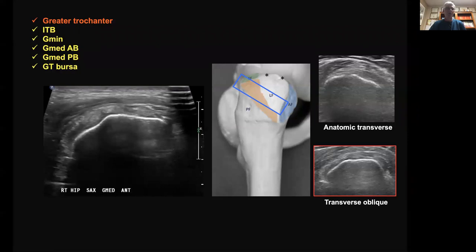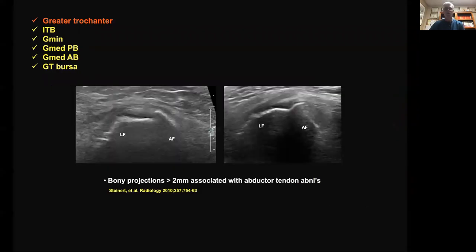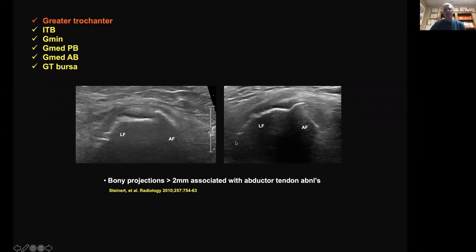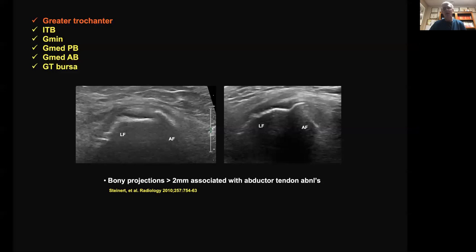A smooth trochanter with G-med problems is unusual. In companion cases we see a very large bony projection between the anterior and lateral facets, with a fair amount of cortical irregularity. The extent of bony projections and cortical irregularities is predictive of the abnormalities you may see in the gluteal tendons — somewhat analogous to the shoulder, where cortical irregularities of the greater tuberosity predict rotator cuff pathology.